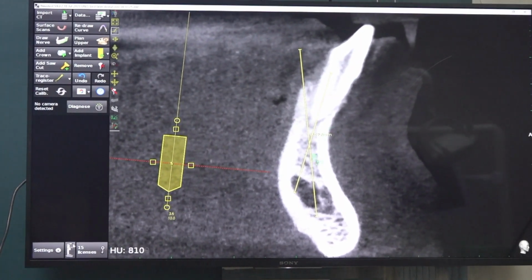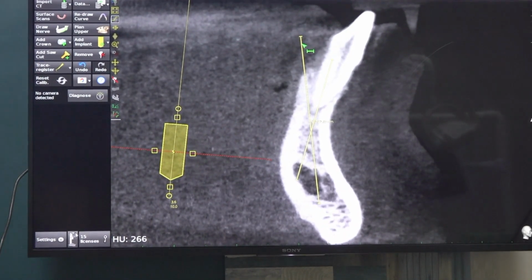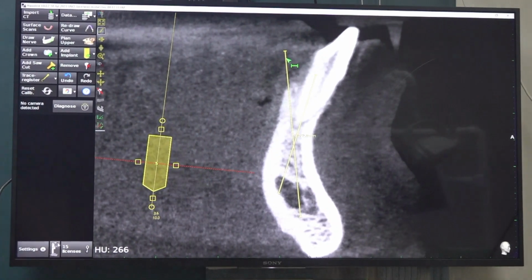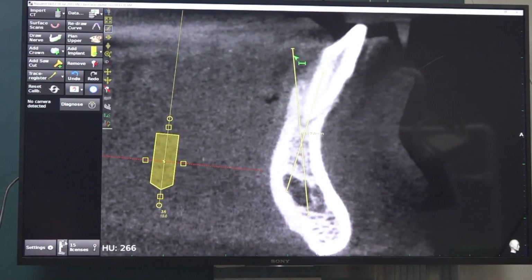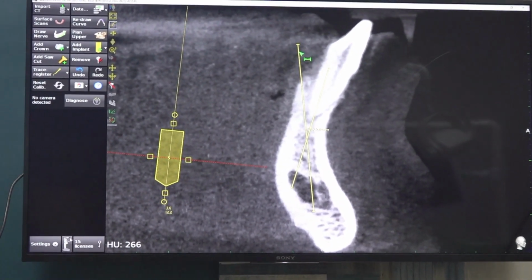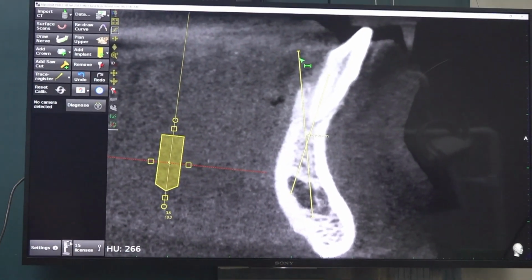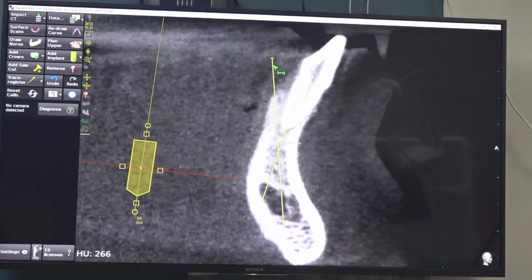After alveoloplasty, if you drill, it will come very lingually. That is why full mouth patients say the lingual portion is bulky and have difficulty, because alveolar bone loss happens and we also do alveoloplasty. The moment the alveolar bone is not present, the drilling angulation changes and the abutment goes lingually. Then the prosthetic challenges will come.